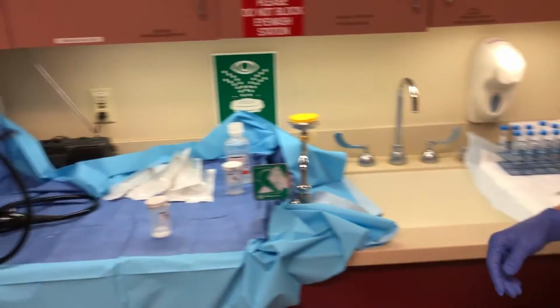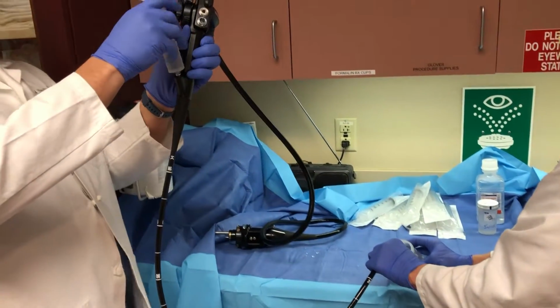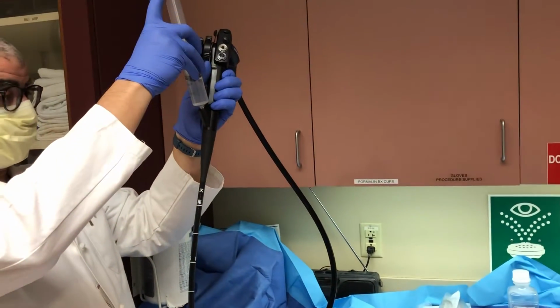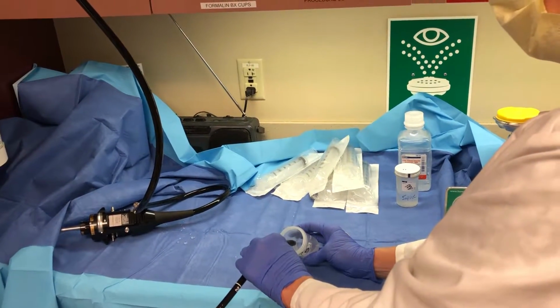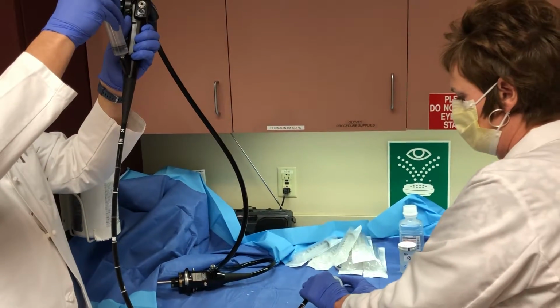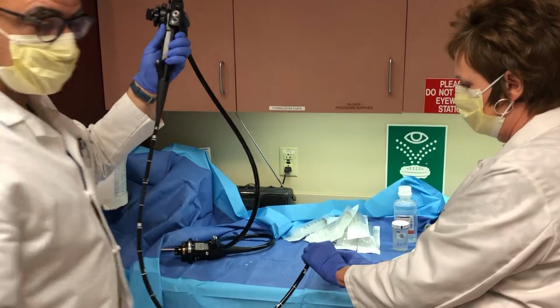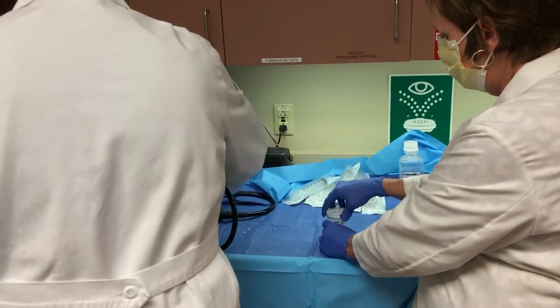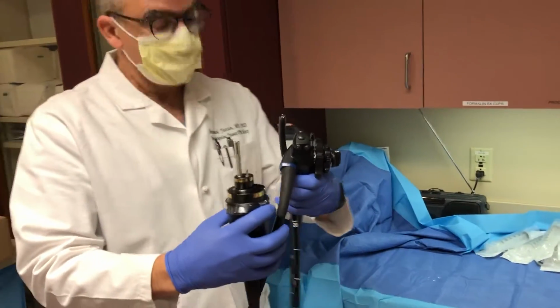Now we're going to do our second flush with the rest of the 30 cc's remaining. Okay, so we've got our sterile specimen, and that's it. Thank you.